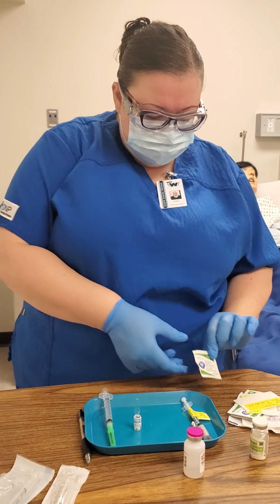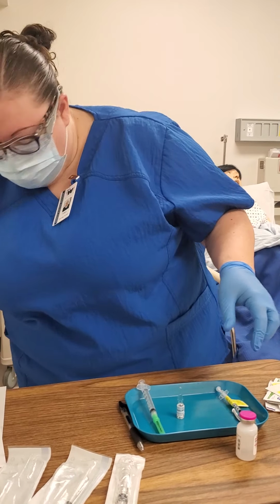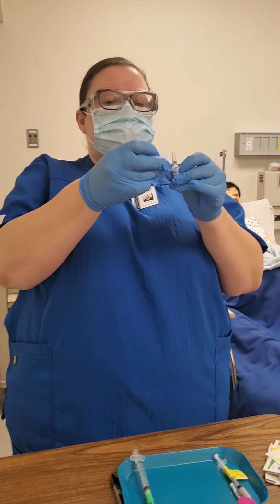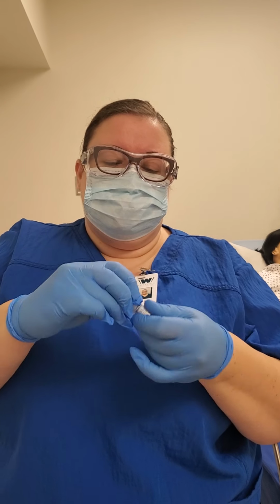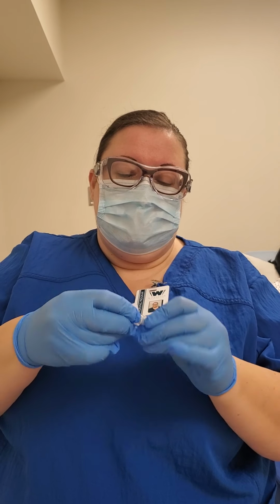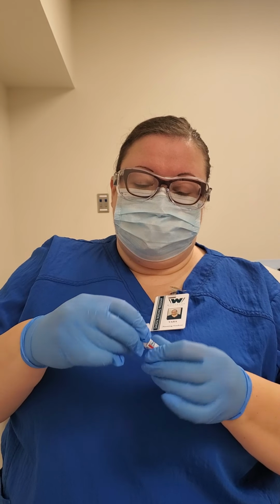Okay, then I'm going to clean the top of the bottle to make sure that there's a white line here on the top of the bottle, which there is. 15 to 20 seconds. I'm going to clean the top of the neck of the bottle, top of the bottle here.